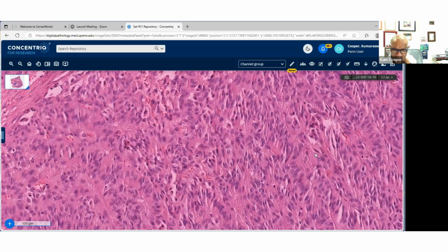I just want to address this final differential, and I appreciate you putting up your differential. I really do, because it helps keep the conversation going. FH, fumarate hydratase deficient leiomyoma. Excellent thought. I know some people do that routinely. I typically would do that if I saw atypia. If I saw atypia in a smooth muscle tumor, then I would resort to FH. We have the antibody, and remember, it's lost.